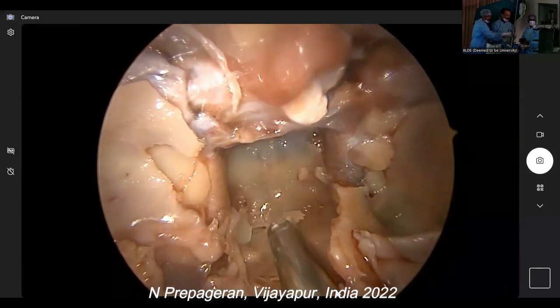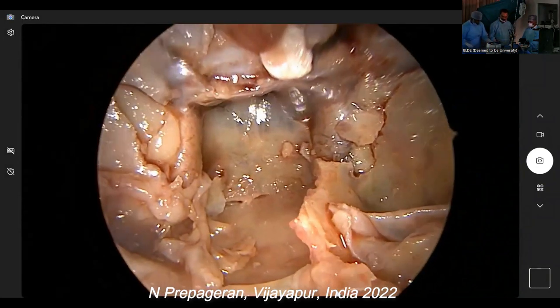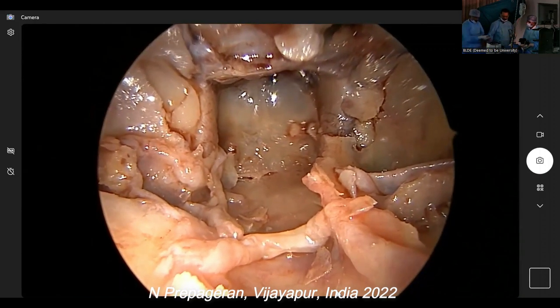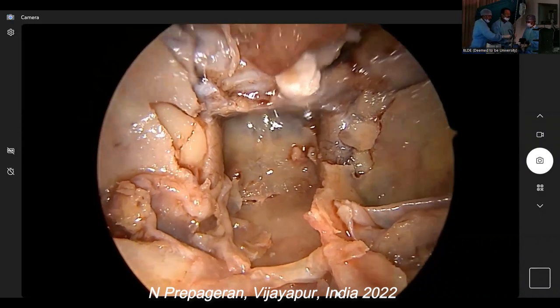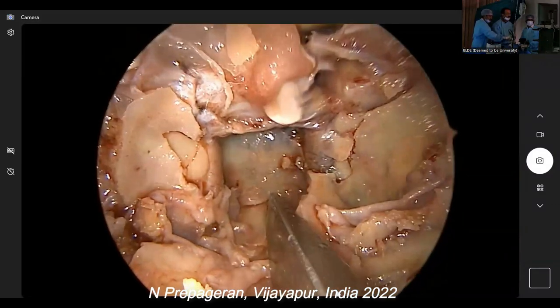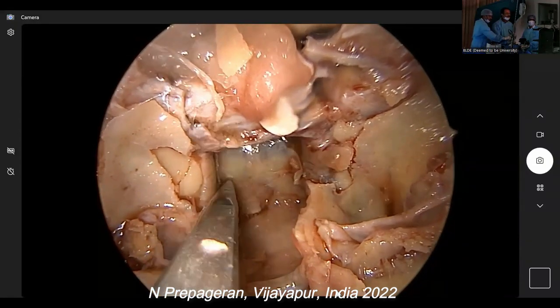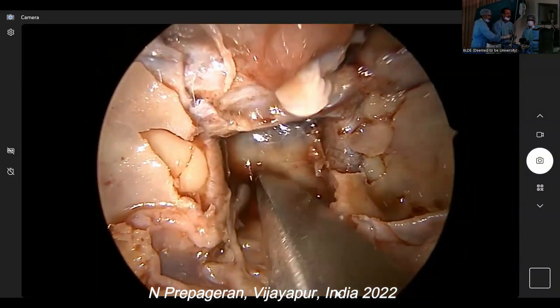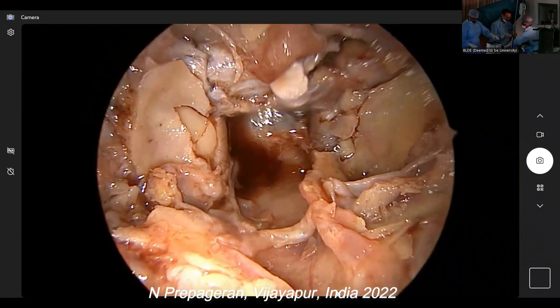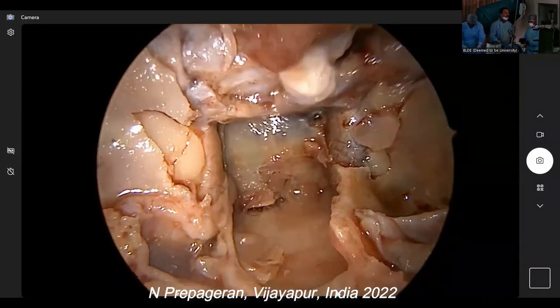All we need is one small space. Then I can use my crescent punch. Chisel again, the big one just now. This space is too big for a small chisel. Good. Did the whole thing go in? Suction. So once you have made a hole in the clivus, okay, curette. We'll use a curette and just flick it.